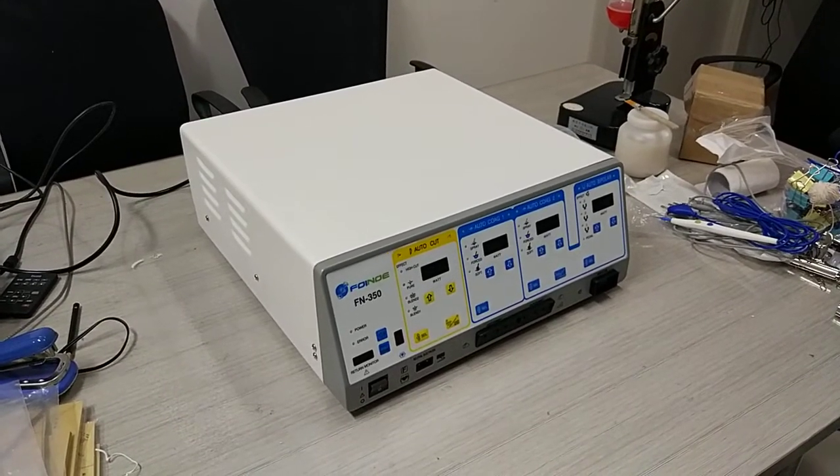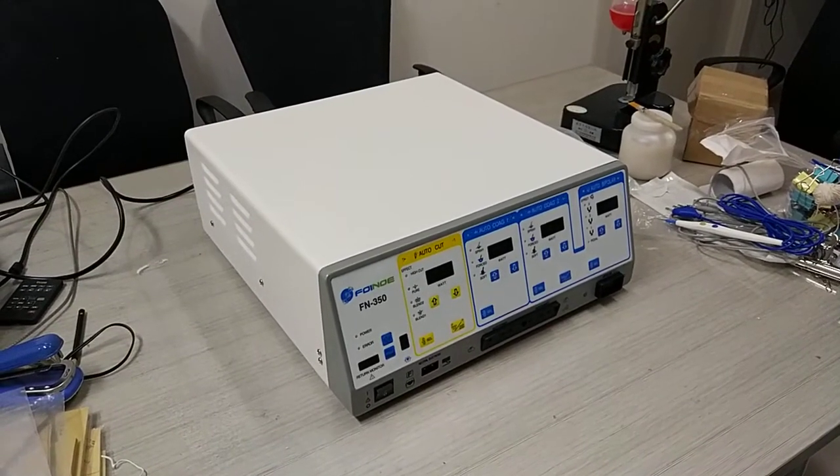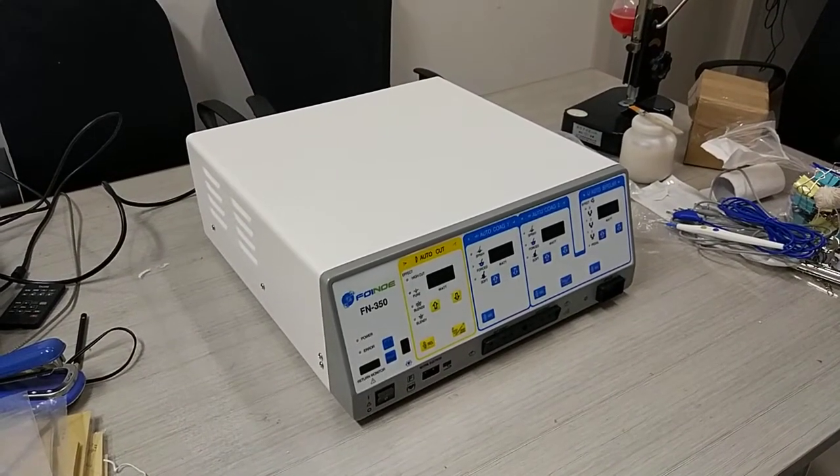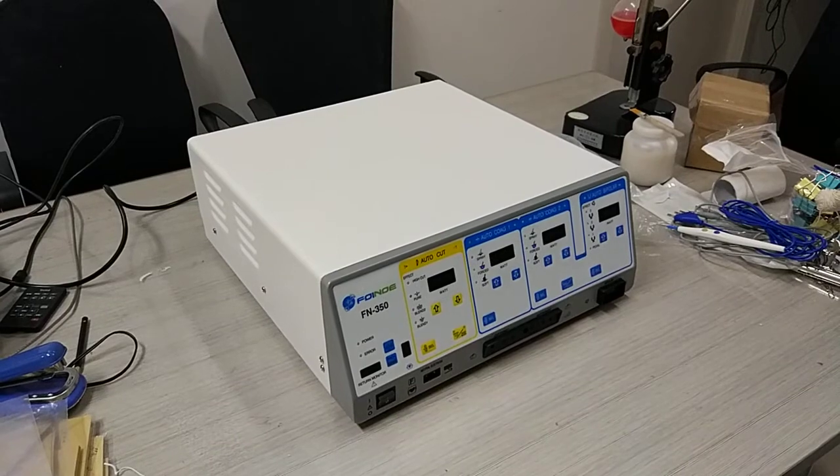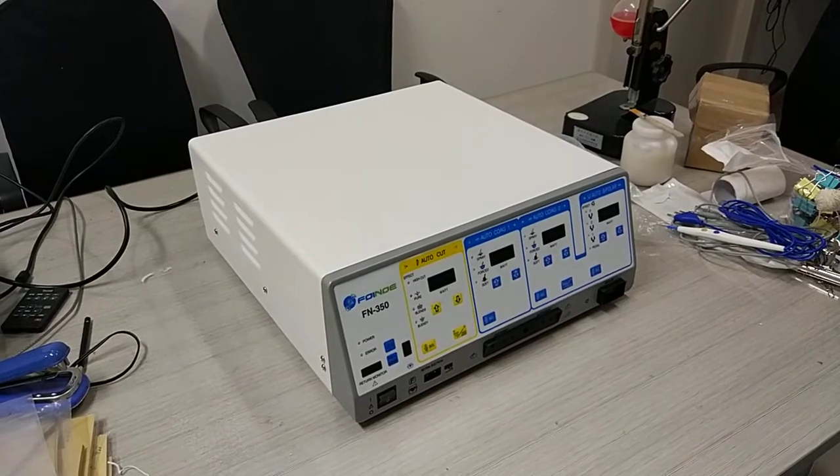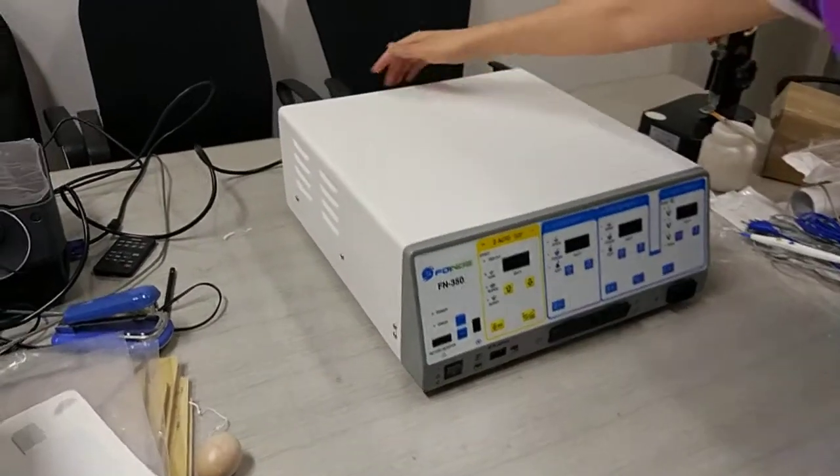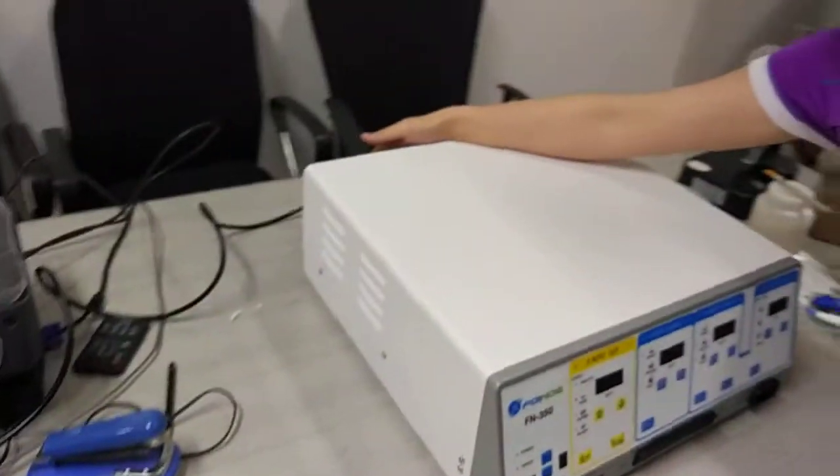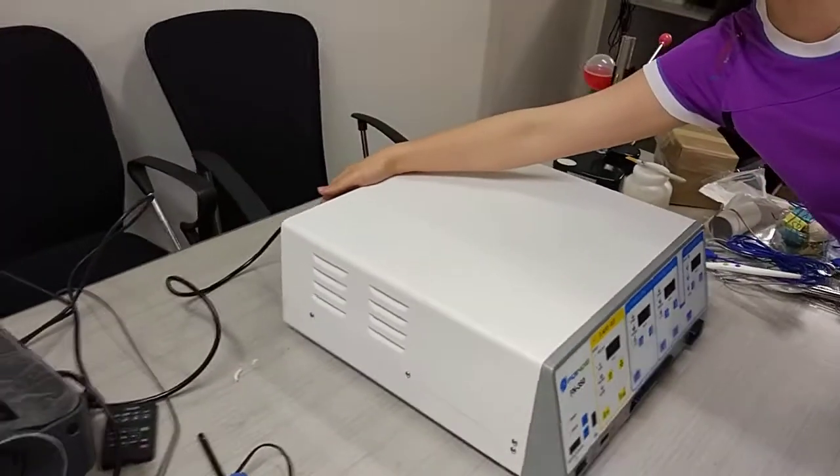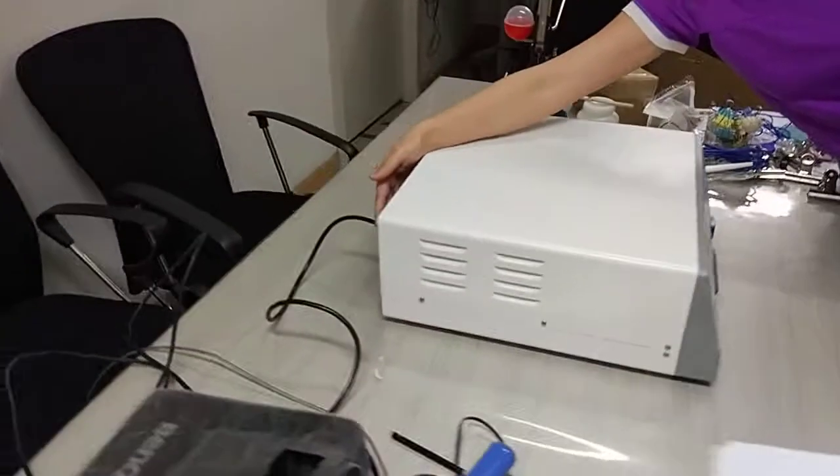How to operate our electrosurgical units. First, before you turn on the power button, try to make sure the power cord is connected to our machine here.